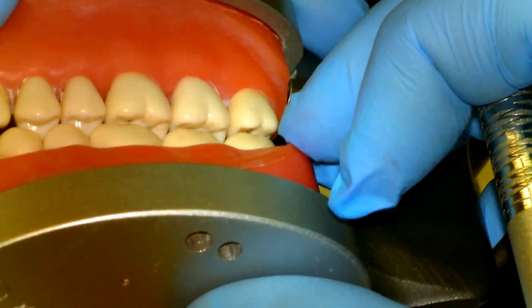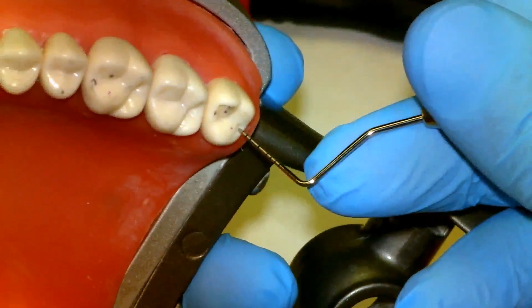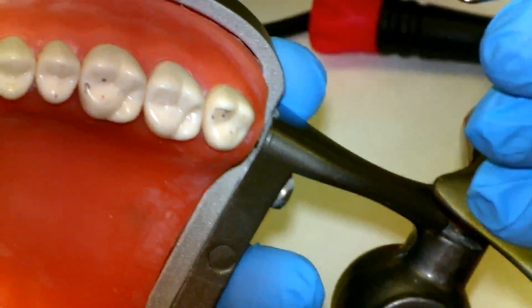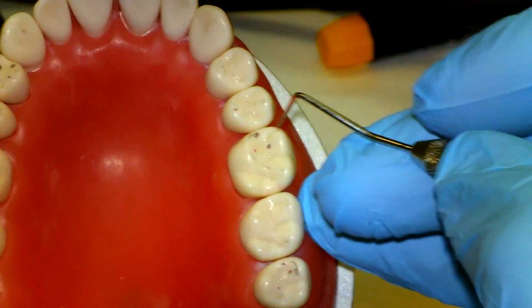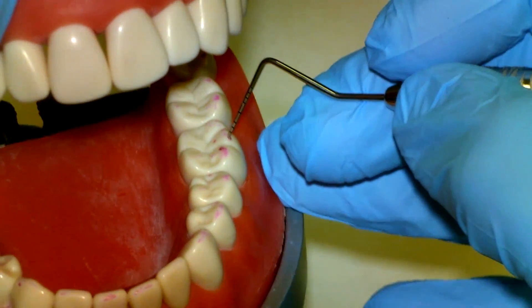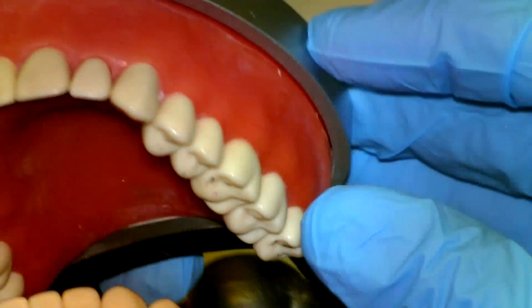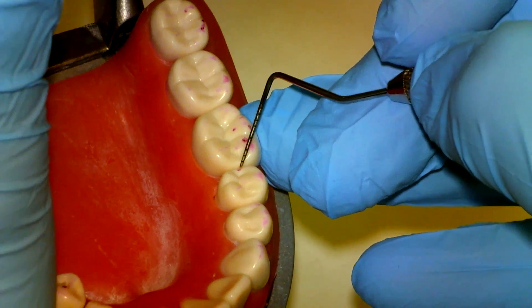Based on our occlusal equilibration criteria, these two marks will need to be adjusted on the maxillary. Since both are on functional cusp inclines, we have the choice to remove from either side. On this first molar we have three contact points as well as a contact on the lingual or functional cusp of the premolar. Matching that up with the mandibular teeth, the three points correspond, and the functional cusp contacts the marginal ridge of the second premolar. We can leave the cusp tips alone but will want to deepen this marginal ridge.